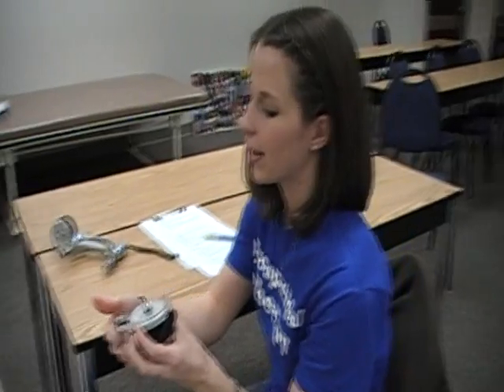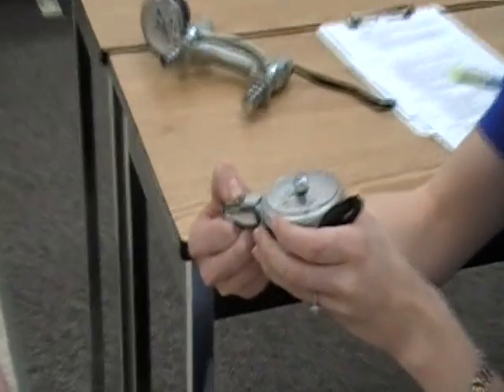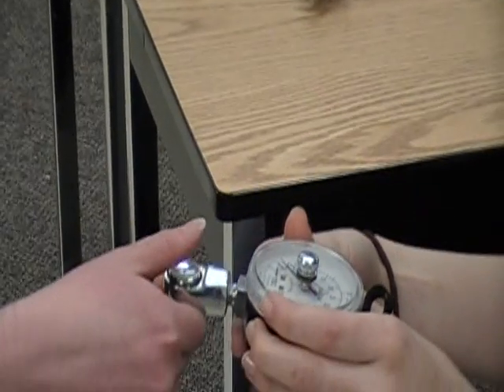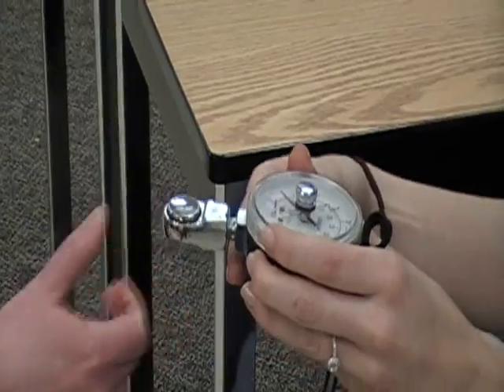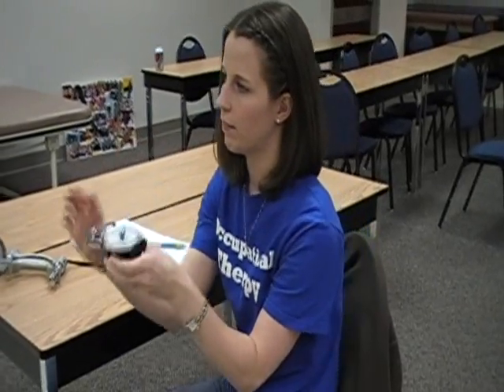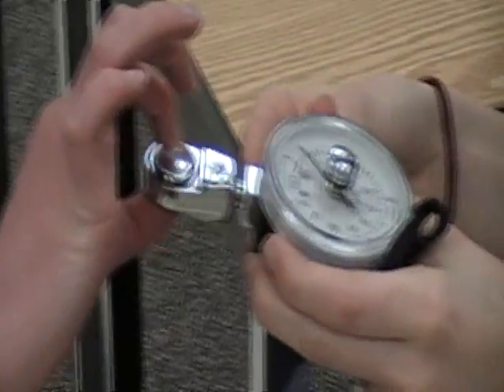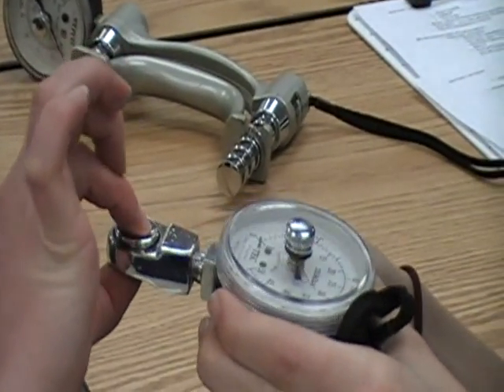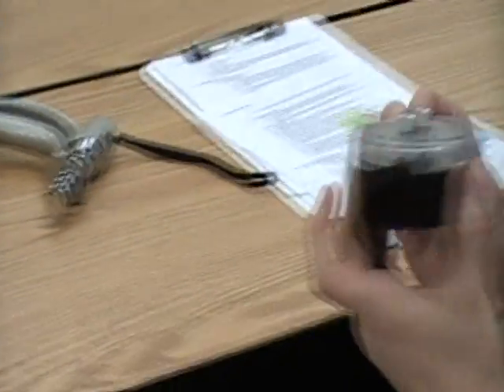Next, do a pinch like you're holding a key — that's the lateral pinch. You would do two more trials and take an average of the three trials together. Last, we're going to do a tip-to-tip pinch with your index finger and your thumb. Squeeze as hard as you can. And again, you would do two more trials and take an average.